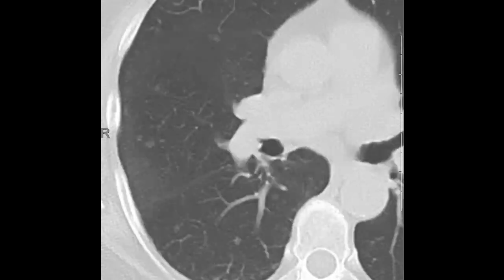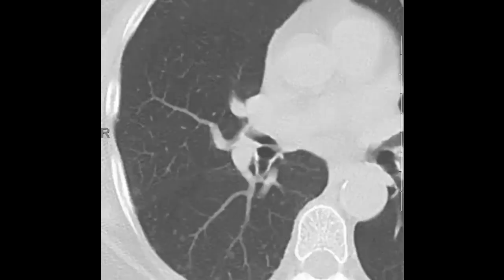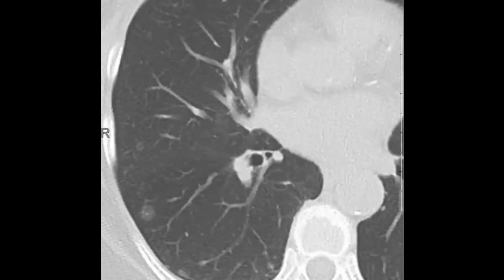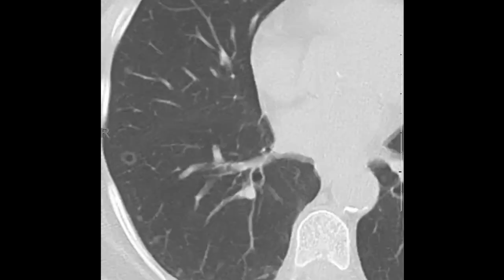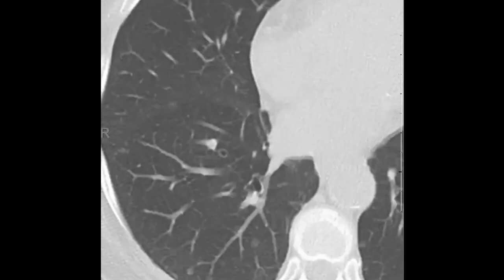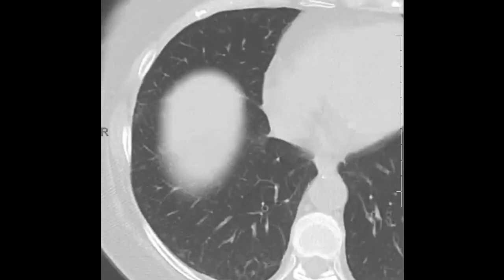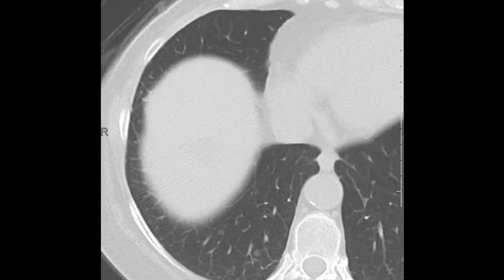Some of these are actually cavitary — if you look very carefully, they almost have that cheerio-like configuration. Some here, some over here, and some frankly cavitary in the right lower lobe. Many have this feeling of a cheerio-like configuration. If you're not familiar with what I mean by this, I encourage you to read this article.